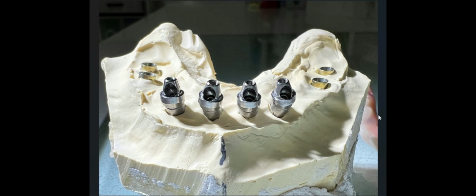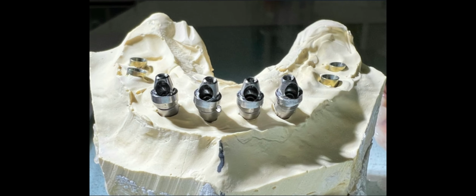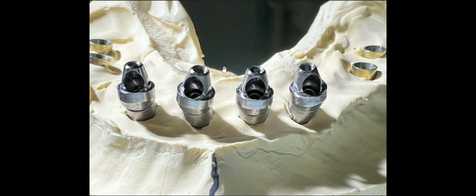And this is just those front re-angulation components on the model. And you can see that it's an additional component that we've had to use to correct some of the work that was done at the front by that other dentist.